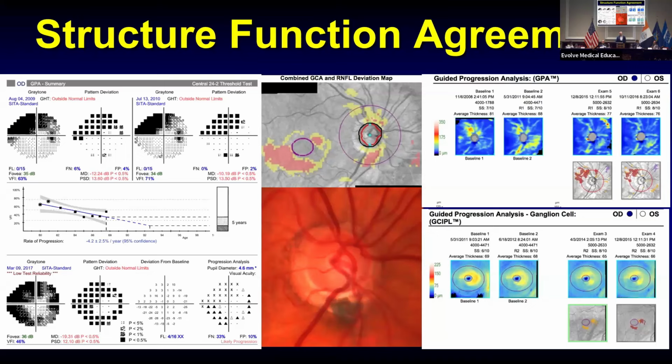And there are a lot of reasons for why one might just see changes in visual fields, but not in the imaging scans over time. But one of the beauties of both having our visual fields and our OCT images is that they have been rather stable over time. You haven't seen a ton of changes in these technologies, making them both backwards compatible and very useful for following patients over the long term.